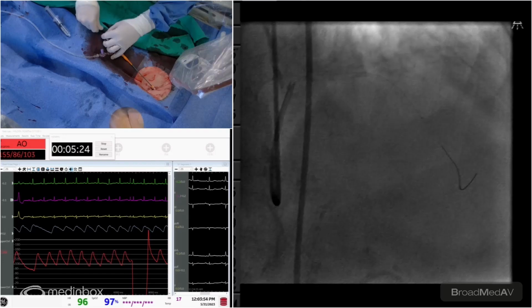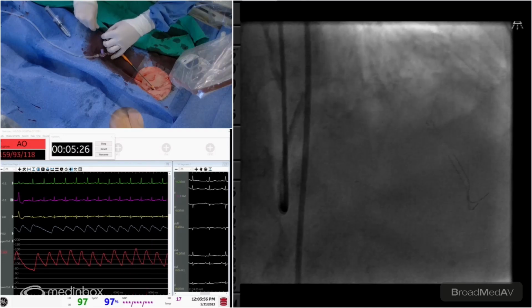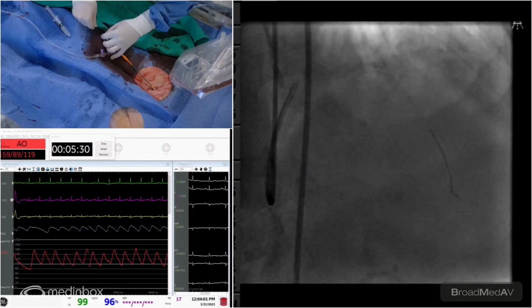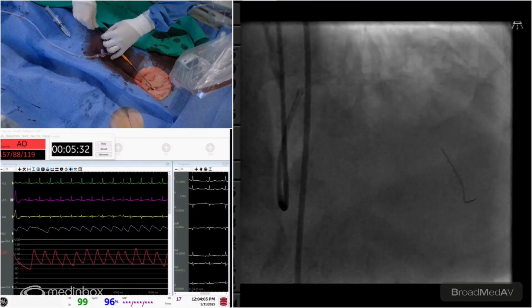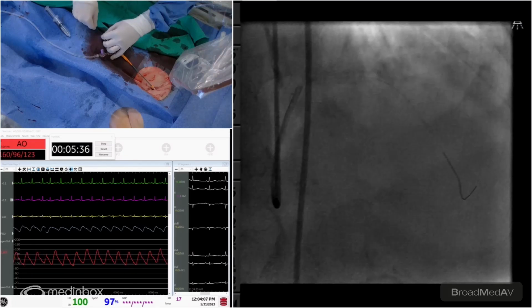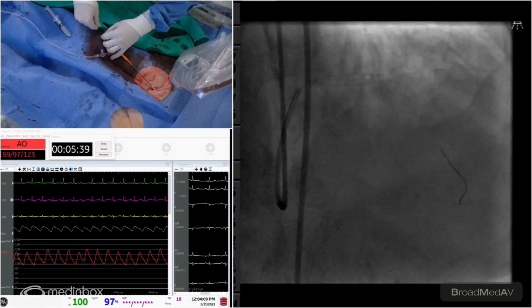So what do you think, Malik? Do we balloon first, see if we can get an OCT across, or just go primary with? I think you probably could try to get an OCT across first. If that doesn't go across, it'd be a low threshold for ballooning. Don't want to modify it too much. It might throw you off with the interpretation of the OCT afterwards.